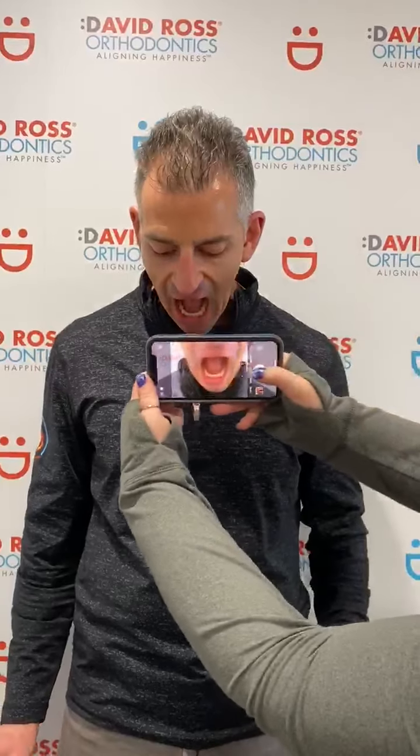There are only two more photos we need to take. One of the lower teeth — this is when you're going to tip your chin to your chest and open wide — and of your upper teeth, where you're going to tip your chin to the ceiling and open wide.